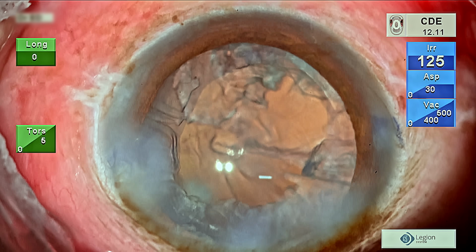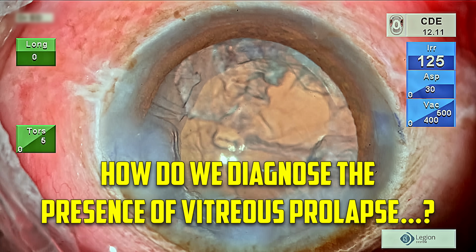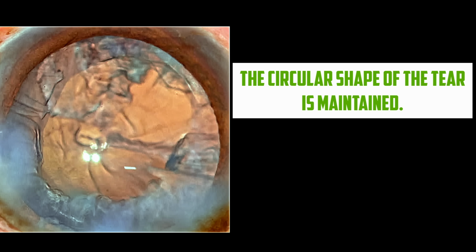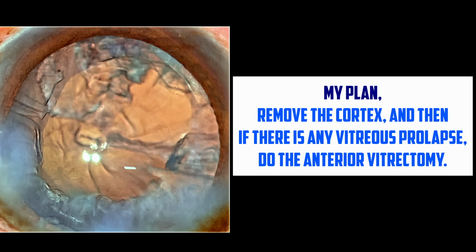He calls for help, and this is the situation where I'm looking at the case now. So at this stage, how do we diagnose the presence of any vitreous? Because the circular shape of the tear is still maintained, putting in triamcinolone acetate at this stage might not give us a very good idea, simply because the OVD would have pushed back any prolapsed vitreous and it wouldn't stain it. So I thought maybe I'll just go in and first try to do some cortical aspiration, and then if there is evidence of any prolapsed vitreous, then definitely I'll start doing the anterior vitrectomy.